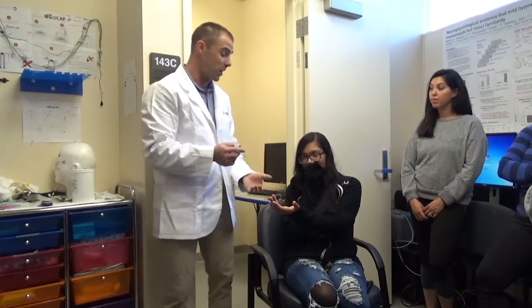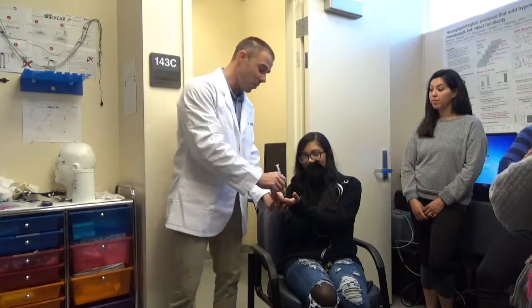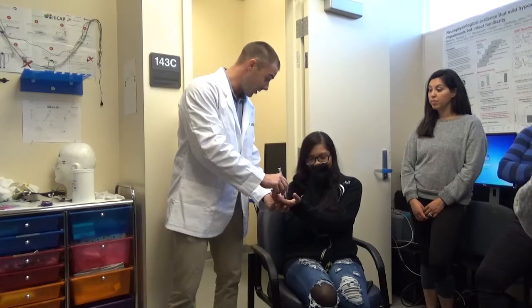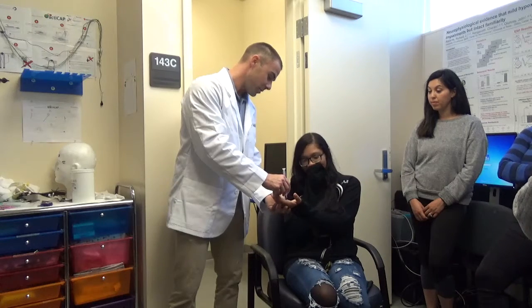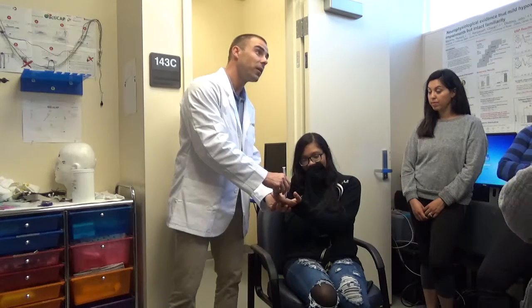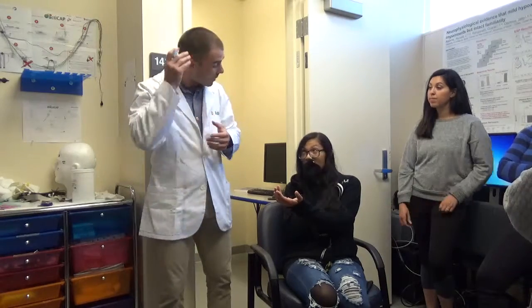But the only reason it hurts is if we do it wrong, if we do it too much, which is why it's really helpful to take some time amongst yourselves and practice and see what's going to be too much. That'll hurt, right? Not really. Okay, so you want to do it nice and light so that you're moving the gel around and it just kind of scratches, just a scratch, and they'll know what to expect because that's going to be on all these different spots on your head.